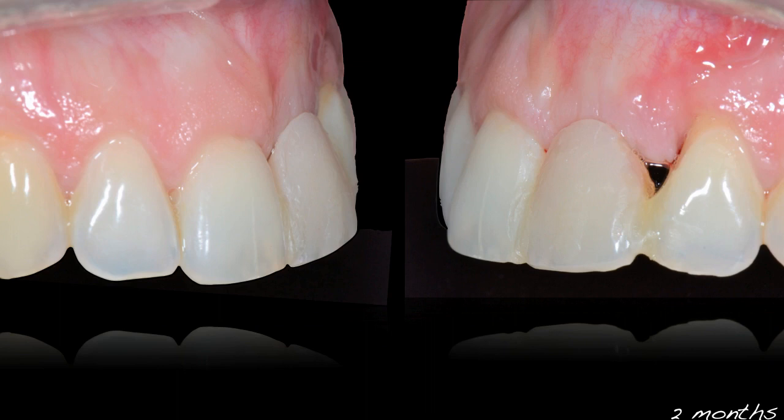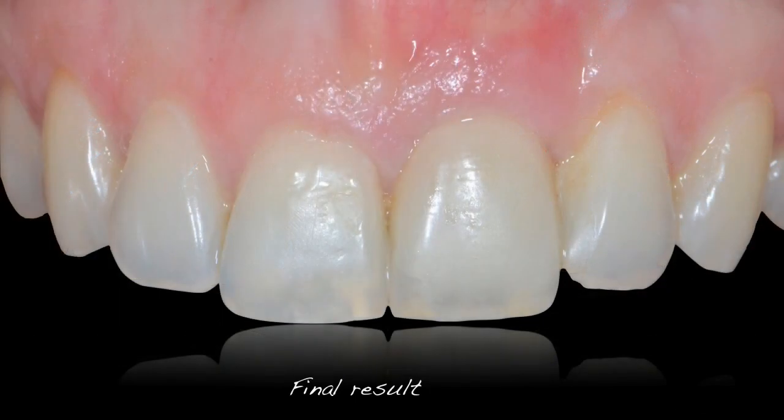This is the final result of the implant after, of course, a provisional phase in which the tissues were pushed out buccally only by pressure, and to adequately create that contour and preserve what was rebuilt of the bone. And this shows clearly with a great tissue match, a great interdental papilla that is present, and of course a great ceramic work done by the referring doctor.